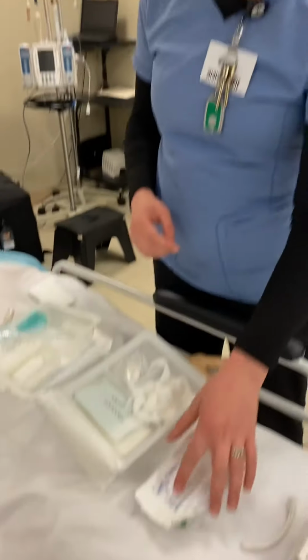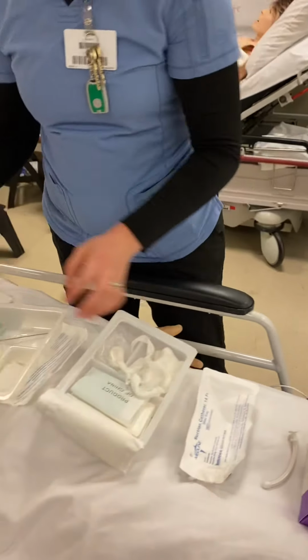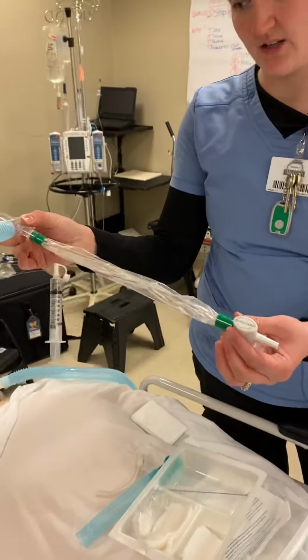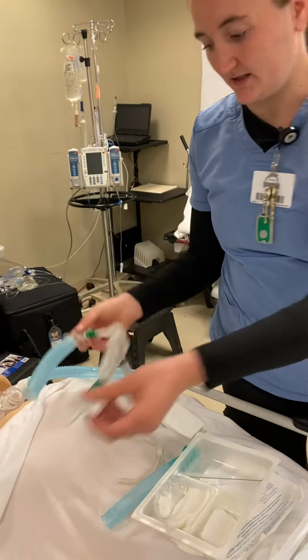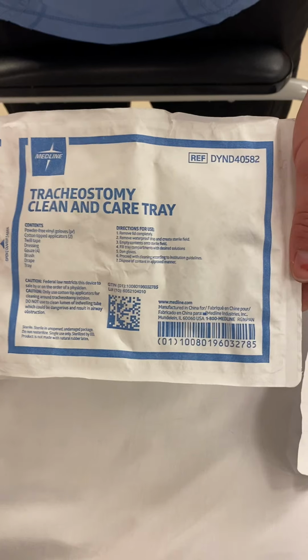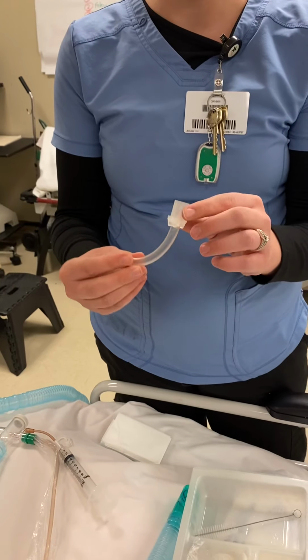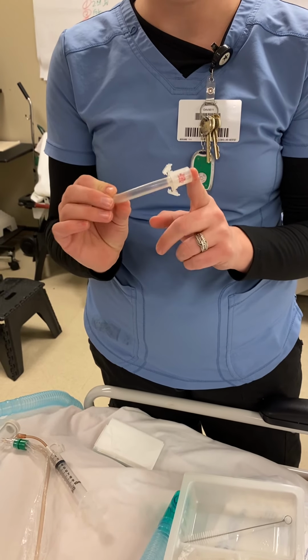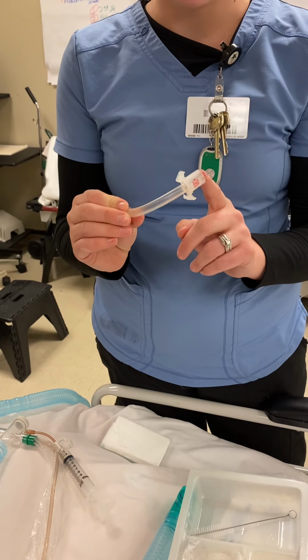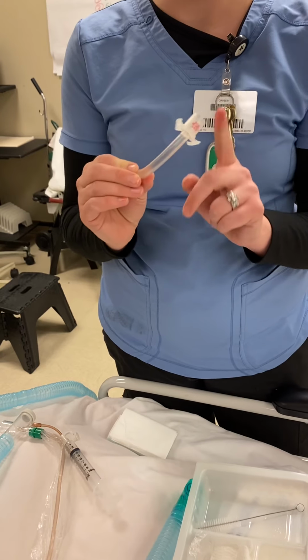A couple of other things, you can use inline suction catheters. We'll go over how to use these. With trachs, you can also have an inline suction as well, and we'll go over how to use that too. And then you want your cleaning kits. These can be found in the ICU supply room, and it comes with all the supplies you're going to need to clean that trach. And then you obviously want, if they are available, the disposable, replaceable intercannulas. If they're not available or your patient doesn't have a disposable intercannula, you're going to want to clean this, and we'll go through how to clean that properly.